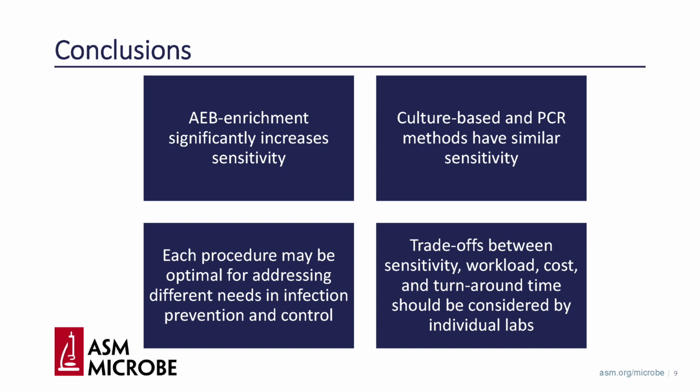So ultimately, when it comes to deciding which procedures to implement, it's important for each laboratory to recognize and consider the trade-offs and balances between turnaround time, cost, sensitivity, and workload in order to determine which procedure would be most suitable in meeting its needs.